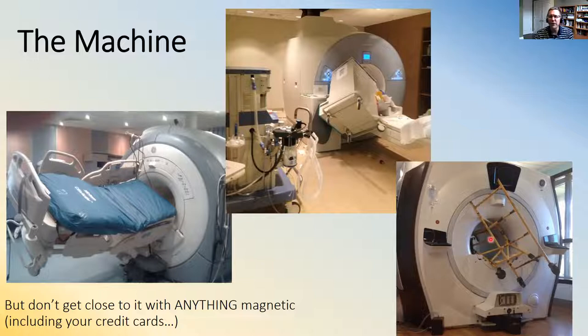It looks like some workers were in the room and they brought their metal scaffolding too close. And this thing probably launched from about 10 feet away and smashed into the bore of that MRI. Here's another example here. This looks like some kind of instrument stand or something like that, because I see a drawer sticking out. These would be common in a procedure room. You know, the technicians are keeping all the stuff inside there.